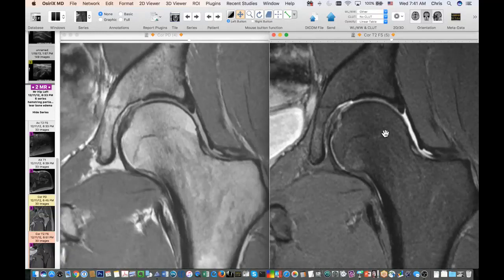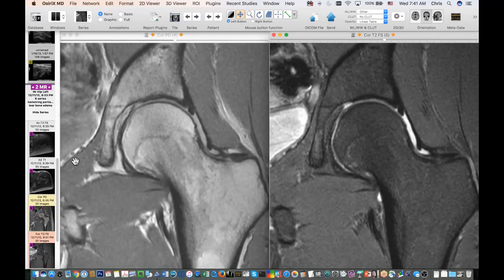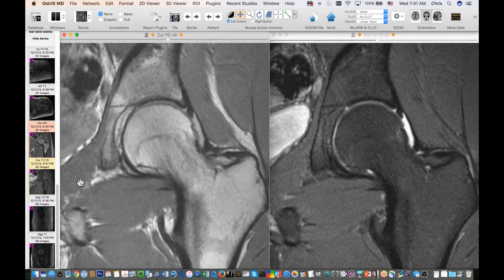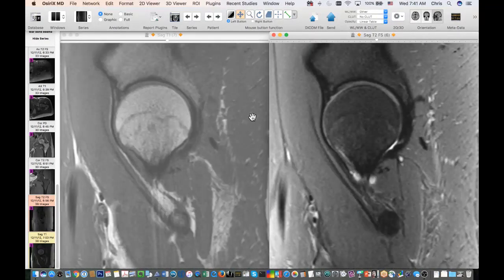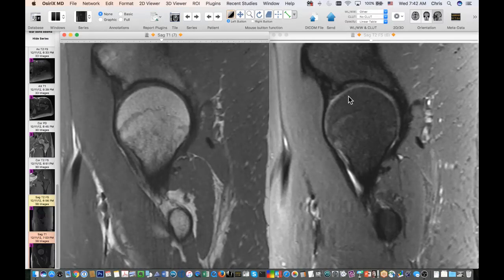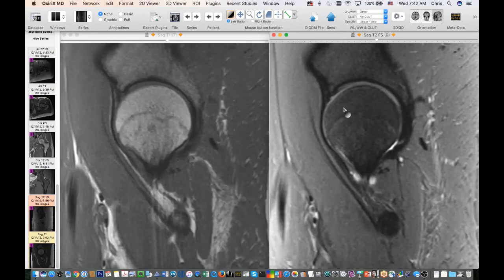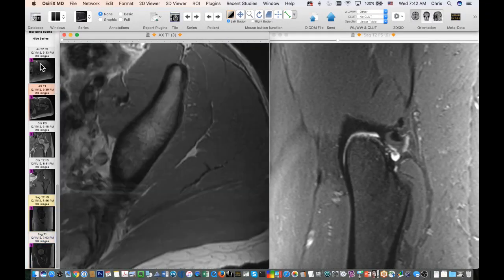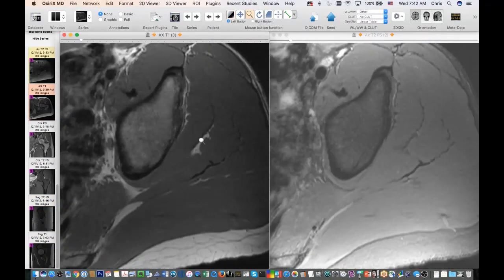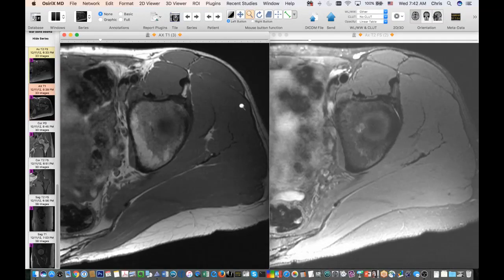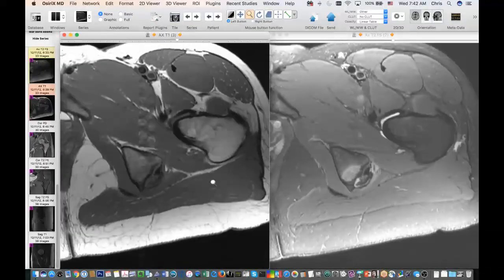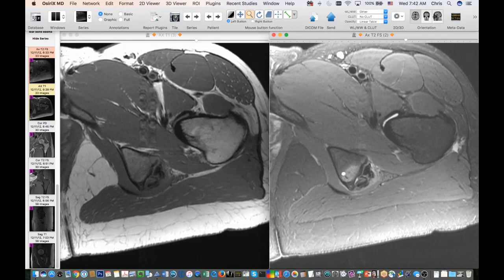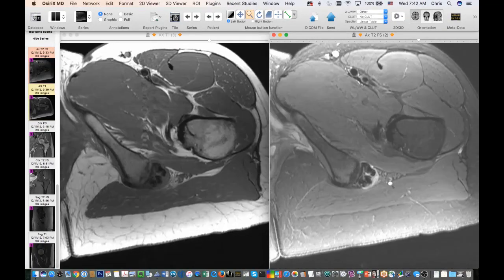On these sequences, you can scroll back and forth to see the thin gray layer of cartilage along the femoral and acetabular surfaces. When looking for labral tears, you're looking for abnormal signal within the acetabular labrum. I go through the coronals, then the sagittal images looking for the same anatomy — articular cartilage along the femur and the acetabular labrum superiorly. Then I go through the axial images for bony anatomy and tendinous structures such as iliopsoas, gluteal tendons, and the rectus. This patient had some hamstring partial tearing with bone edema in the ischial tuberosity and partial tearing of the proximal hamstring tendons.